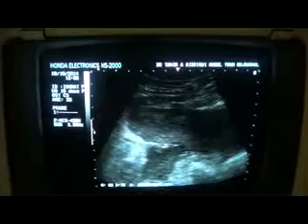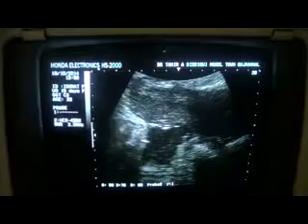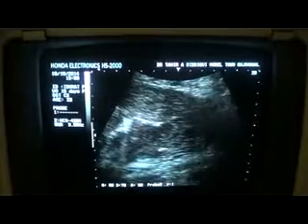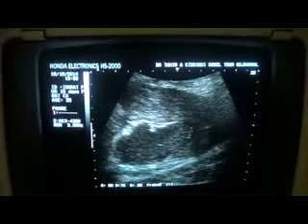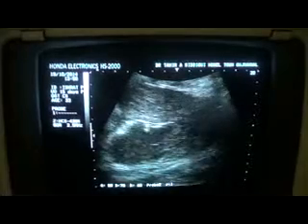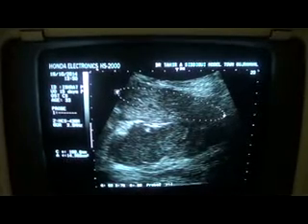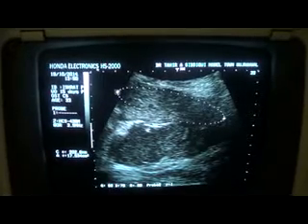Secondly, you see that there is fluid posterior to the uterus that extends up to the cervical region, with multiple echogenic, tiny shining particles within it. This is the uterus. As I am giving a bit of pressure, the scanning plane has changed, therefore you will see only this much of the uterus.